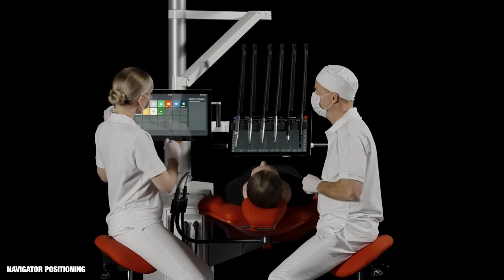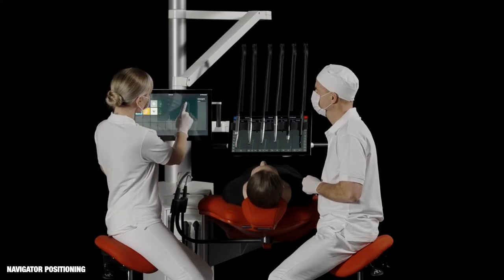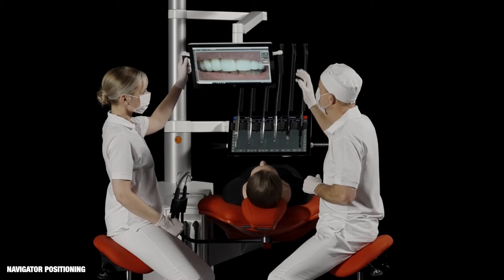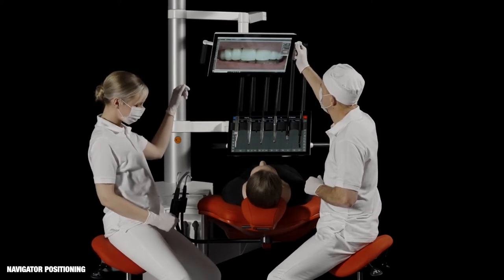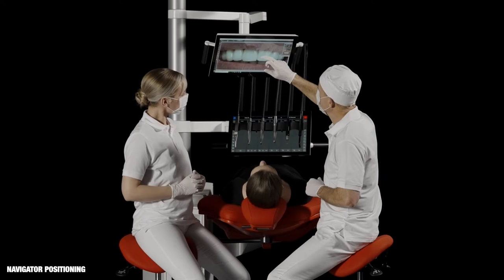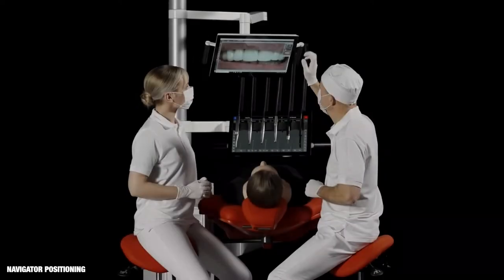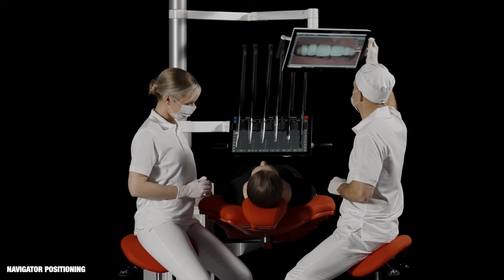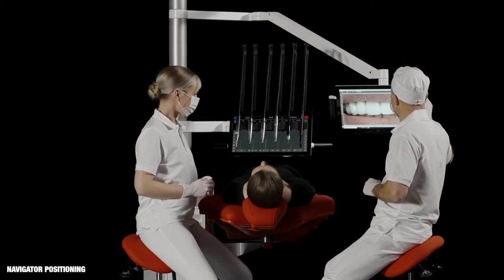Due to the long and flexible arm, the navigator can be positioned on the chair side assistance side of the unit, in a patient viewing position over the patient's head, or on the dentist's side of the unit, always within the field of peripheral vision.